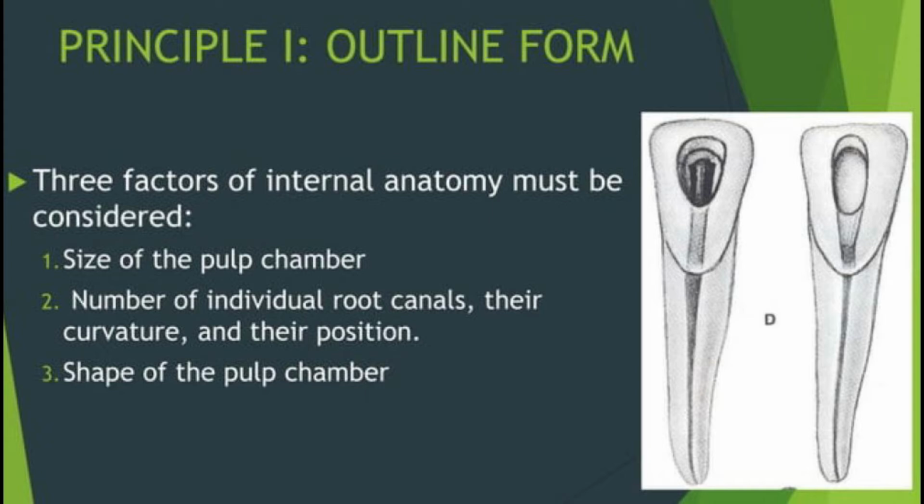And last is the number and direction of the root canals. It can be determined by the number, position and curvature of the canal.